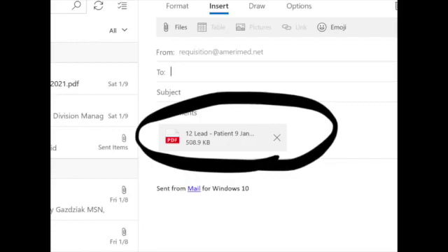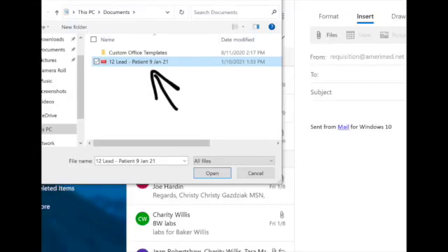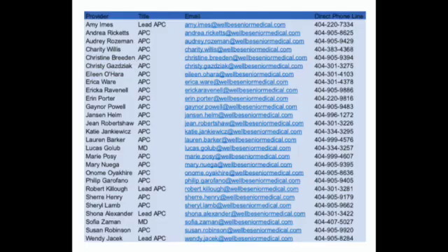3. Add the doctor and the APC emails in the To field. If the addresses are not pre-programmed, you will find a current list in your unit's binder. 4. Add a subject line and message body as appropriate and tap the Send icon. 5. Interpret your patient's ECG in the usual manner. 6. Call the doctor and/or the APC to discuss the results and a treatment plan.